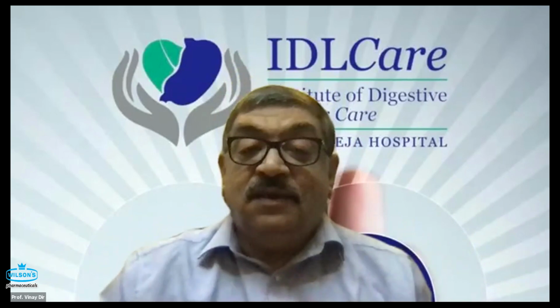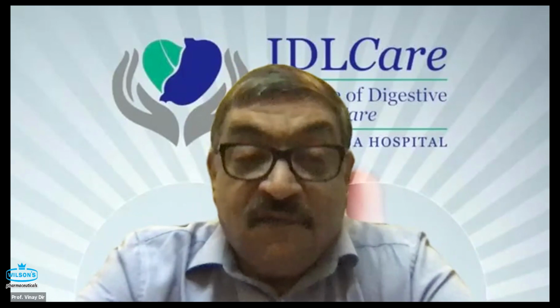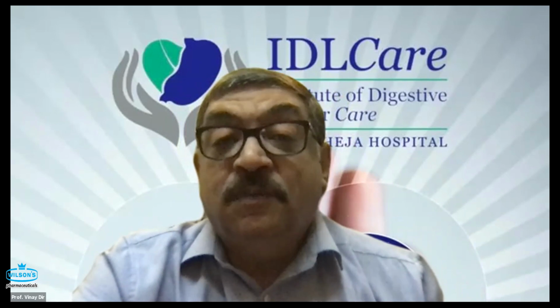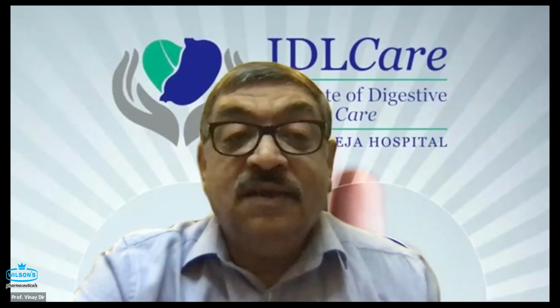So there are lots of unanswered questions regarding EUSBD replacing ERCP. Yes, it is a candidate as of now, but we will see how the future unfolds. I want the stents to improve. They are very, very good, but I think there is a lot of scope for improvement in the stents, EUS specific stents. I need the accessories to improve, but at the same time, the cost should come down. Then only it is a worthwhile procedure. Otherwise, ERCP is already there. Why should we replace it?